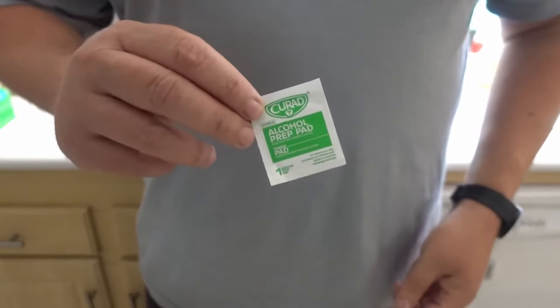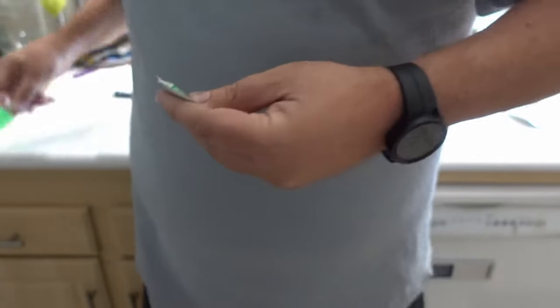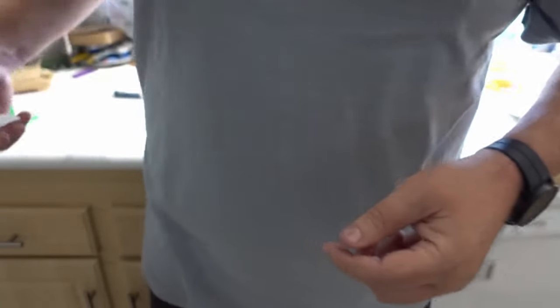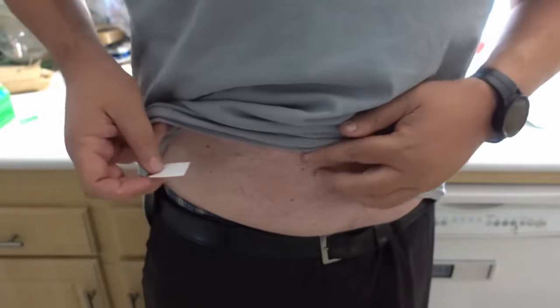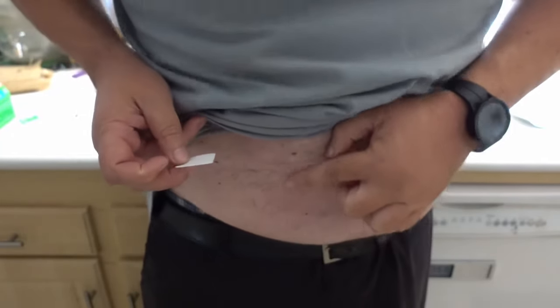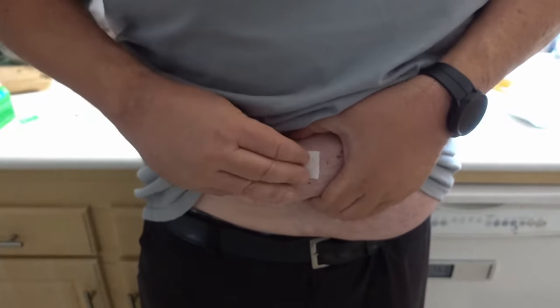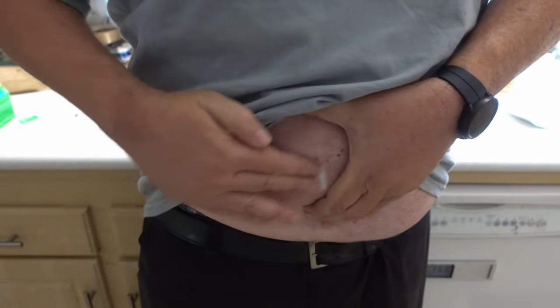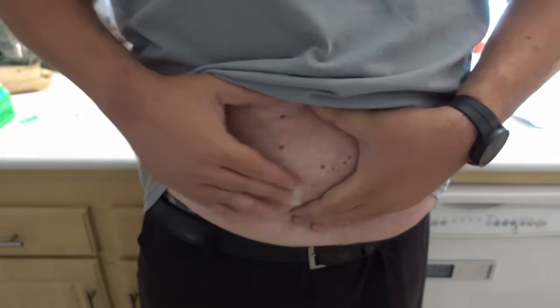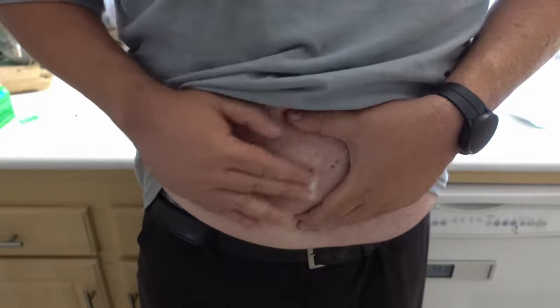To inject the dose, I'm going to use an alcohol prep pad and rub that on the injection area. Make sure you wash your hands first before you do an injection — you want to try to be as sanitary as possible. You want to be anywhere more than 1 inch around under your belly button. Clean the area really, really well — I usually like to go for a minimum of 10 seconds to make sure the area is nice and sanitary.